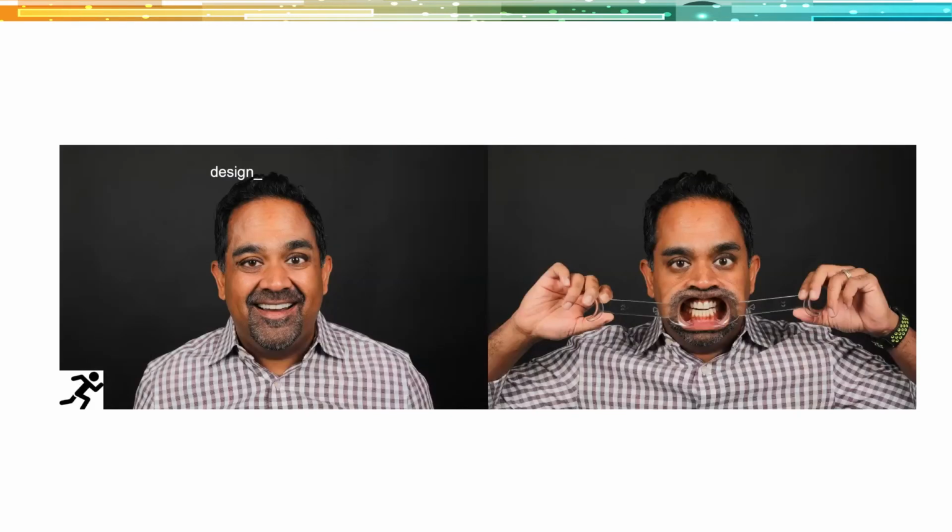And when we get into the Smile Design software, this is kind of a funny picture, but these are the two most important photos that you need to take if you're going to do a digital smile design. And you can see here, using myself as an example, you need to get the patient to be looking straight at you. If they have glasses, you have to ask them to take them off. And you really want a big, goofy kind of grin smile with the teeth apart. And we typically will take the picture on the right first. So we need to have the retractors in, need to have the arches open, need to be looking straight ahead.